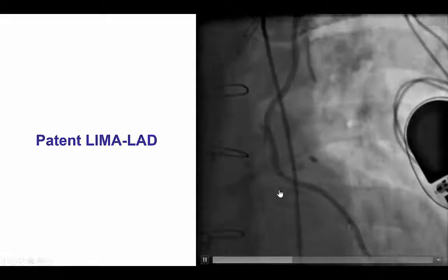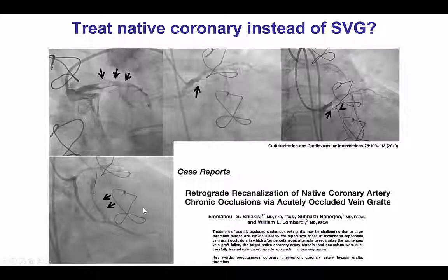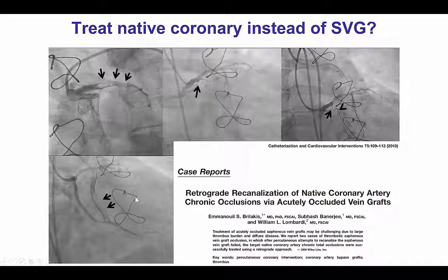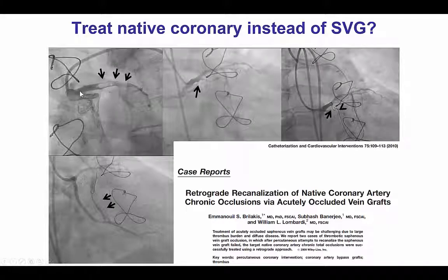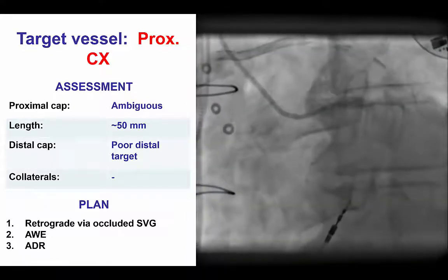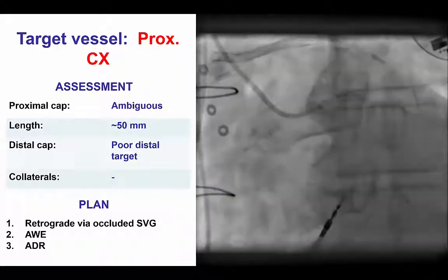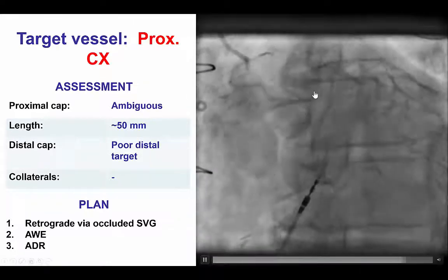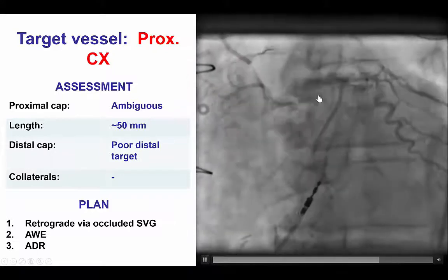He did have a patent LIMA to LAD graft with good flows. The question was whether to re-canalize the vein graft to the obtuse marginal, which was the culprit, or re-canalize the native coronary artery instead. There are several reports from 2010 in which patients with acute vein graft failure can be treated by re-canalizing the native coronary using CTO techniques. The plan was to attempt to re-canalize the native circumflex CTO.